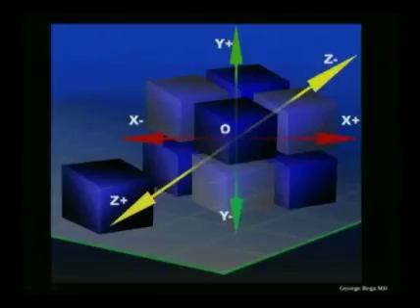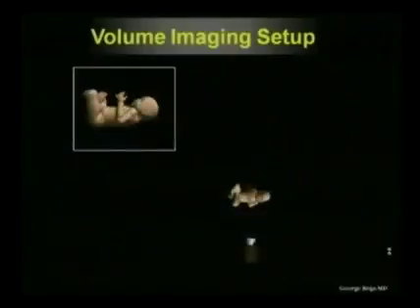Typically, most ultrasound systems have by default one single central light source, but some of the newer ones are contemplating and adding additional light sources, not only in image planes that are perpendicular to the ultrasound beam, which is what works right now. As you can see, these voxels here are more illuminated in the center, and there are different shades of gray in the periphery. And I'll show you a diagram of how that works.